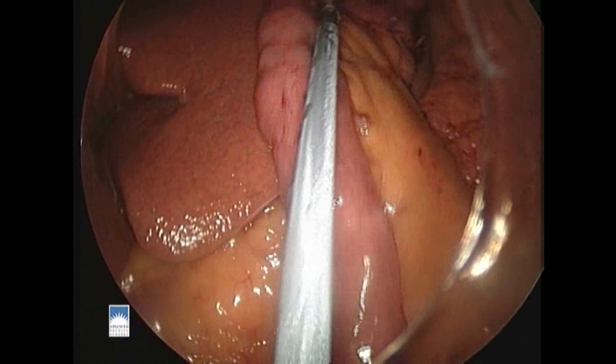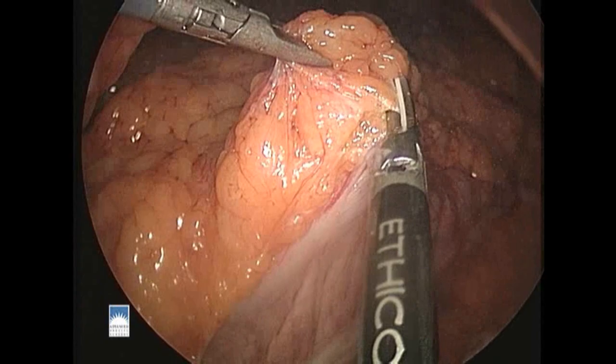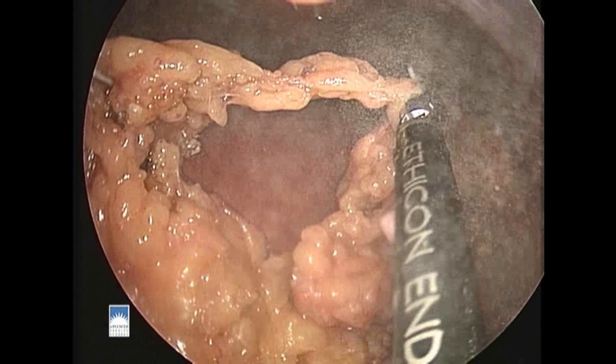Now we're ready to bring the Roux limb up toward the top of the stomach. In order to eliminate tension as a problem, we divide the omentum that sits on top of the colon. This allows a trough to be made so that the Roux limb can sit in this trough and reach up to the top of the stomach with as little tension as possible. Here we're dividing the omentum with the harmonic scalpel, which allows division of tissues without much bleeding.